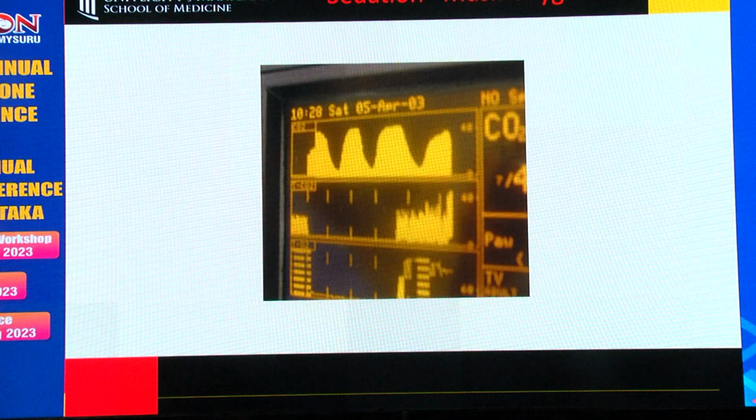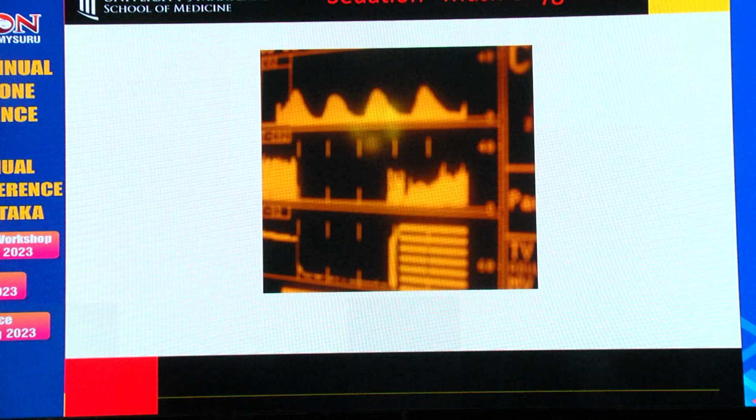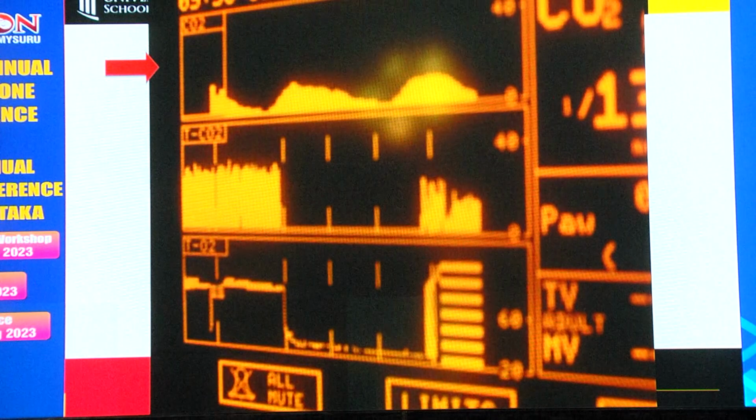Now, what happens in sedation? You are putting on an oxygen mask. Everyone asks me, what is the normal CO2? It doesn't matter. The shape of your CO2 will be slightly different here because of the dilution by the oxygen. So under those conditions, you take that as the normal value before sedation. What is important is the change from that status after giving sedation, which will tell you that this patient is either hyperventilating or is going to go into airway obstruction. And I put an algorithm of how to use capnography during sedation on the website. You can see it under the sedation part of the website.